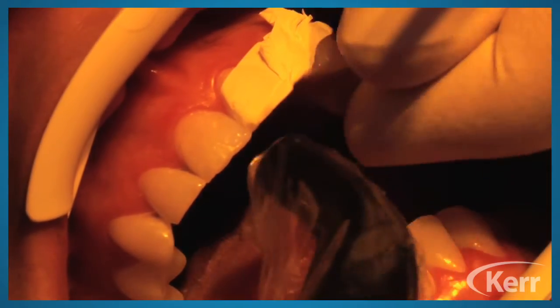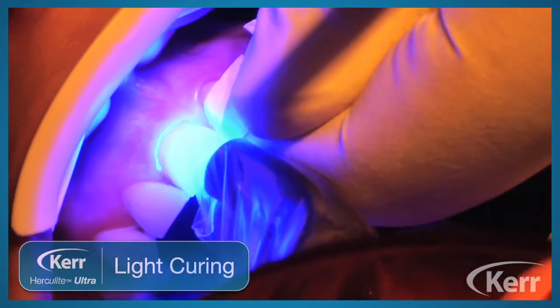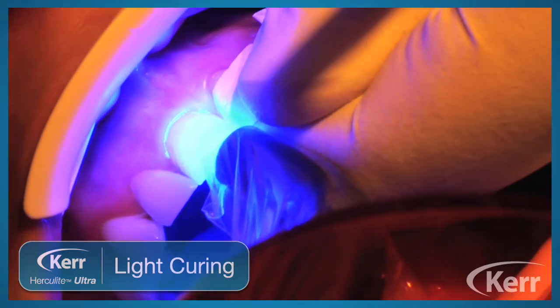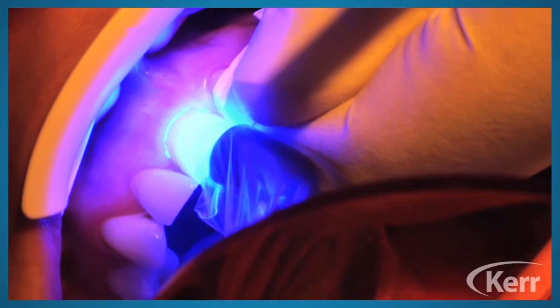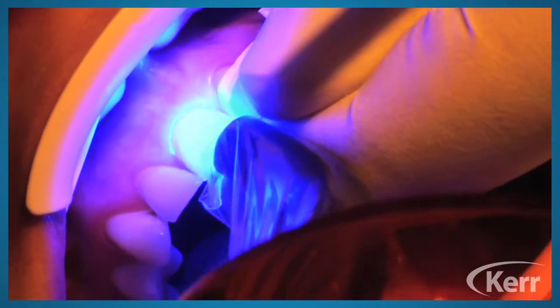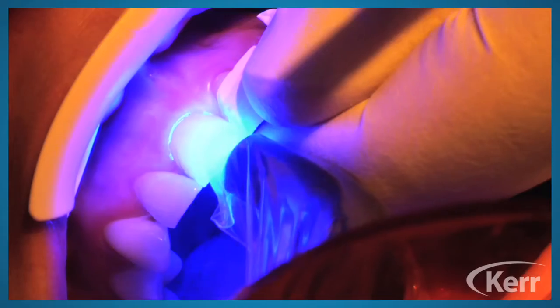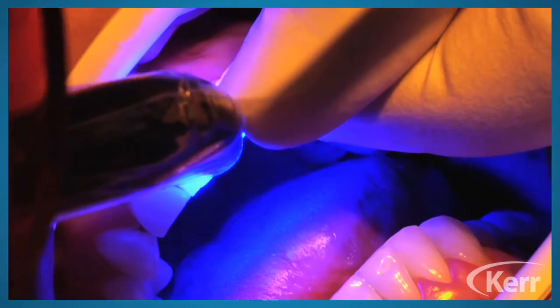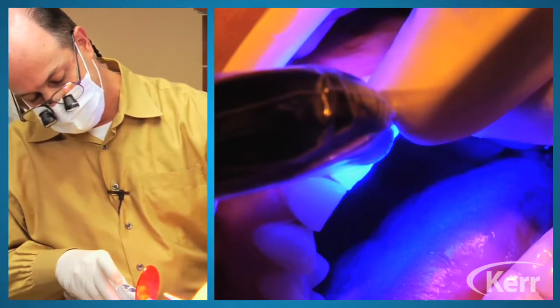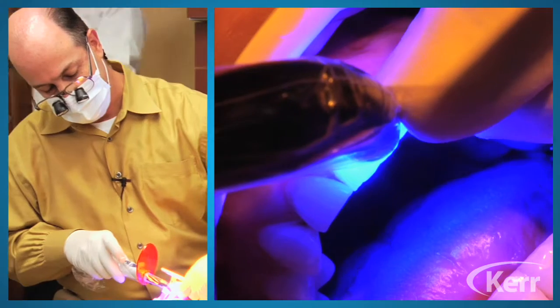Okay, so you can see, really just put on a very thin layer, second layer there, very thin amount. So hopefully you get a feel for how simple the system is. If you've taken a composite workshop from me before, many times I'll teach you need to use 2 or 3 shades, and many times I'll use tints.